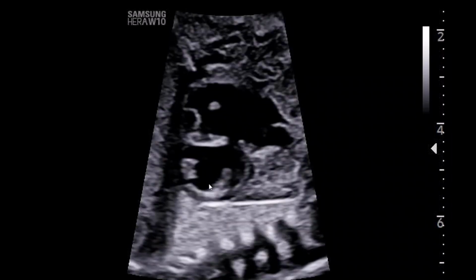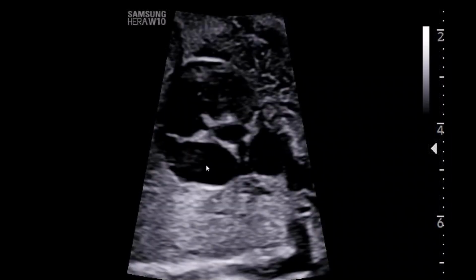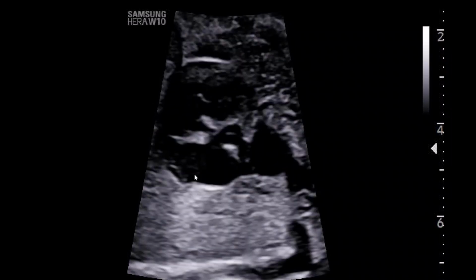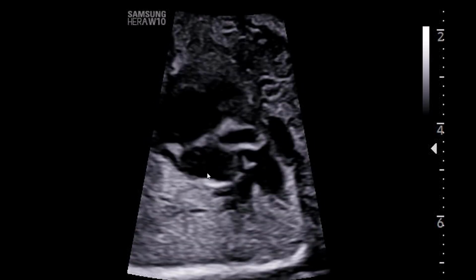You can see the two papillary muscles in the left ventricle associated with the mitral valve. And you can see the mitral valve here en face and the tricuspid valve here. And then at the end of this very rapid sweep, we see the flap of the foramen ovale. This is the plane of the atrial septum, and you can see the opening of the foramen ovale here. The flap is appropriately in the left atrium there.